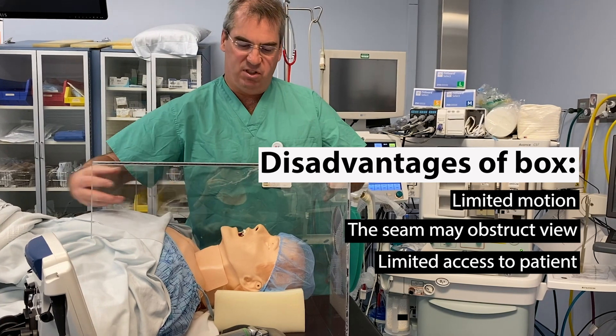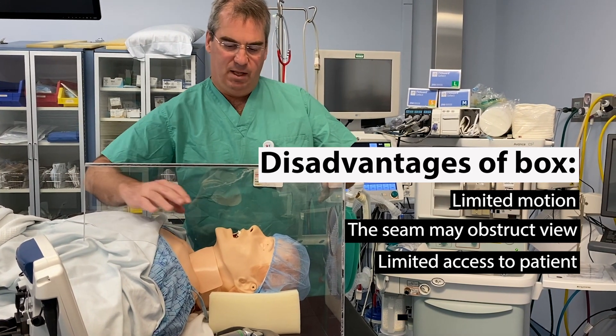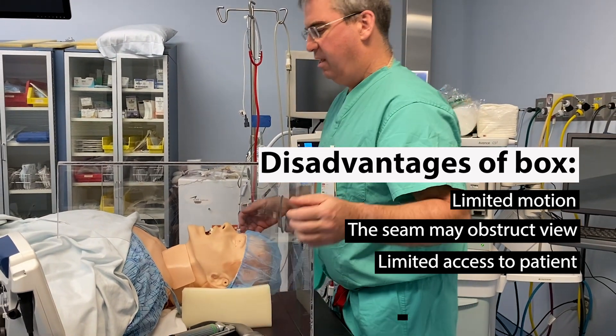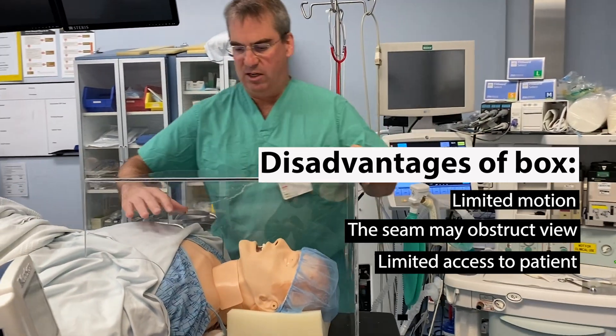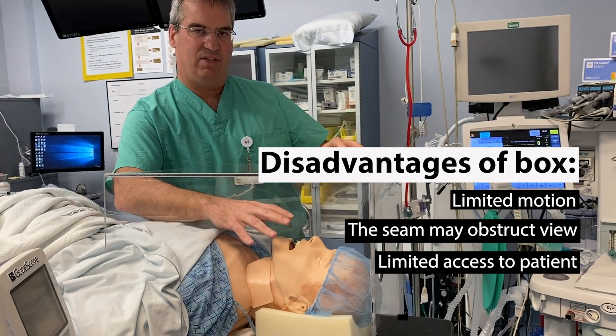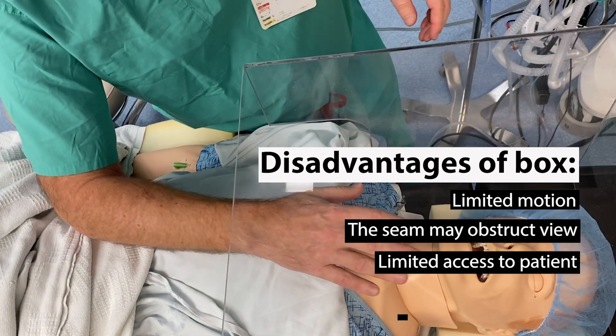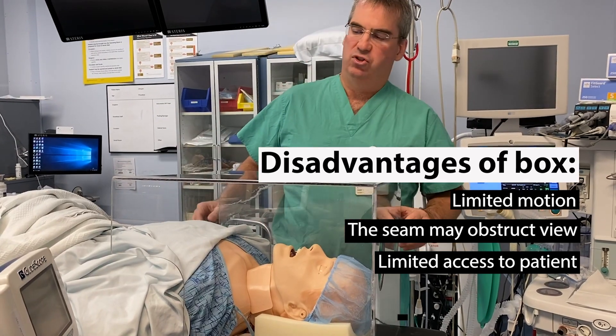Everything that comes into the box needs to be coming this way, including suction and everything. And there isn't anyone that can help you by handing you things. If they do need to try and help you, they don't have the same access because everything is very far. They can't just grab through the plastic — they have to grab through the plastic this way and come up and try to help you, which is a little bit more cumbersome.